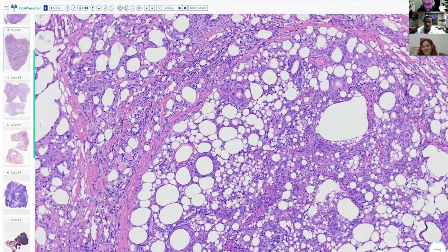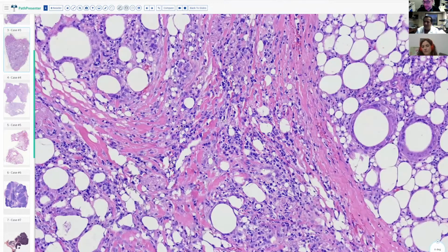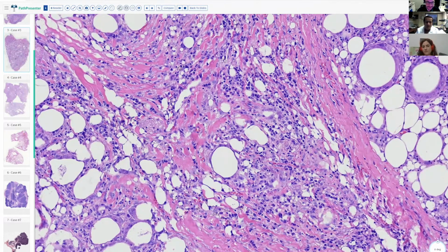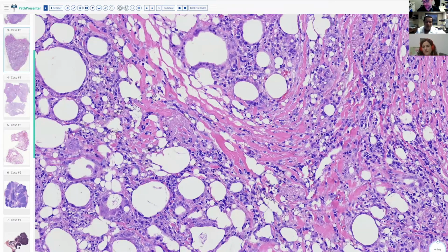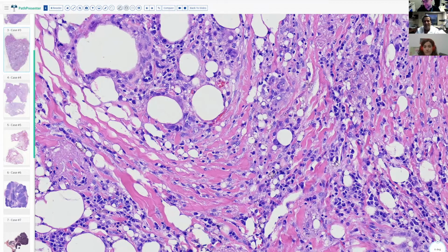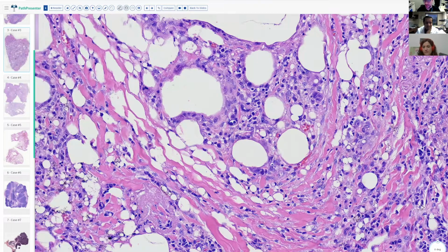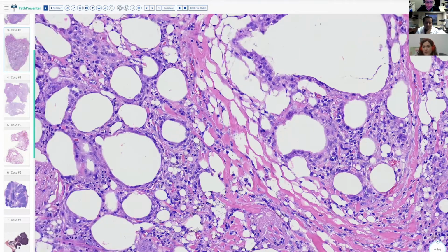Yeah, such a good case to know, Matt, because with the vaping thing, people badly misinterpreted foamy macrophages as exogenous lipoid pneumonia. I was just thinking to myself, if they had seen even one case of a real exogenous lipoid pneumonia, they would never make that mistake. I think the big things that differentiate it are the coarse vacuolated macrophages in the interstitium, as well as a patchy giant cell reaction to it. It's definitely a different case.